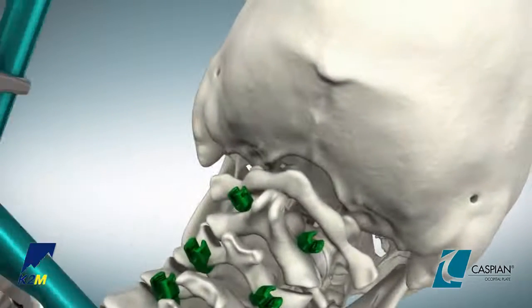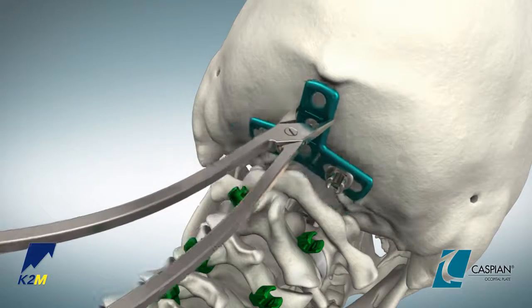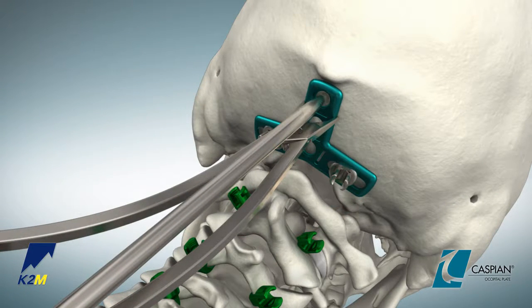Using the occipital plate holder, position the plate on the occiput. Use the awl to perforate the occipital cortex.